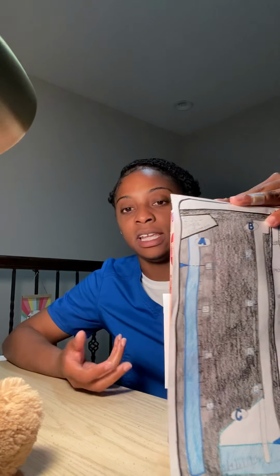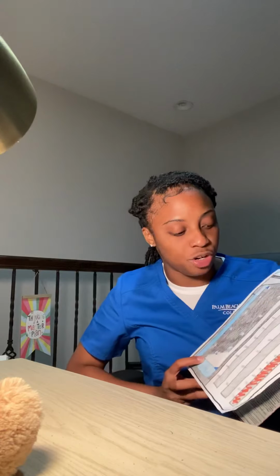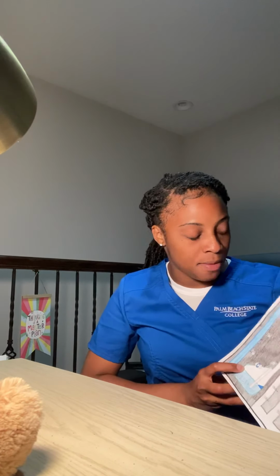And wherever I see the leak, I can go ahead and change out the tubing. Sometimes I may even need to change out the entire drainage system. But being that my patient's drainage system is working perfectly fine, we're getting some good output. Right now we're at 140, so I've already noted what time it is and the date, so that we can see where my patient's at the end of shift.